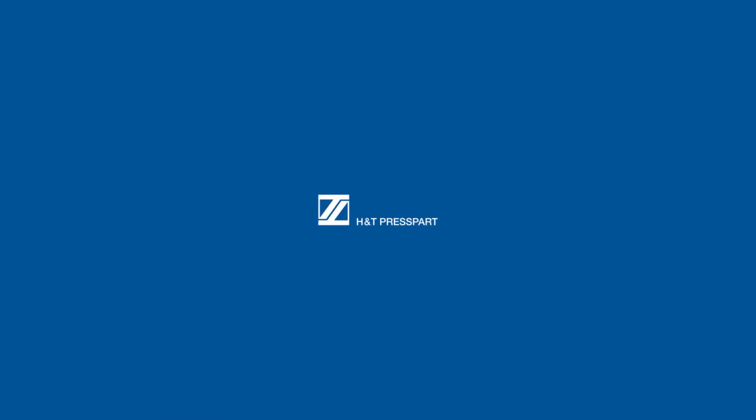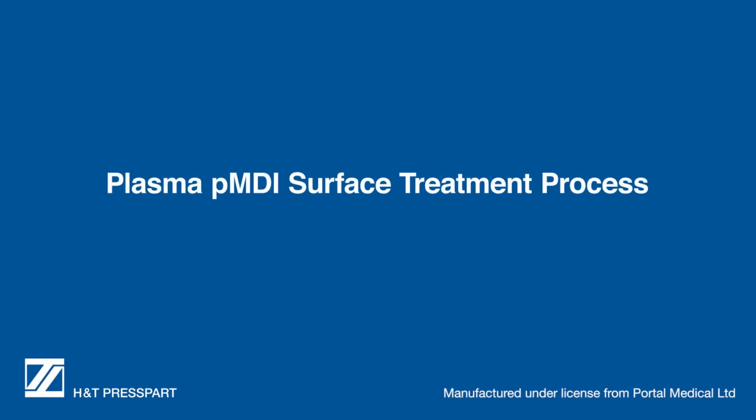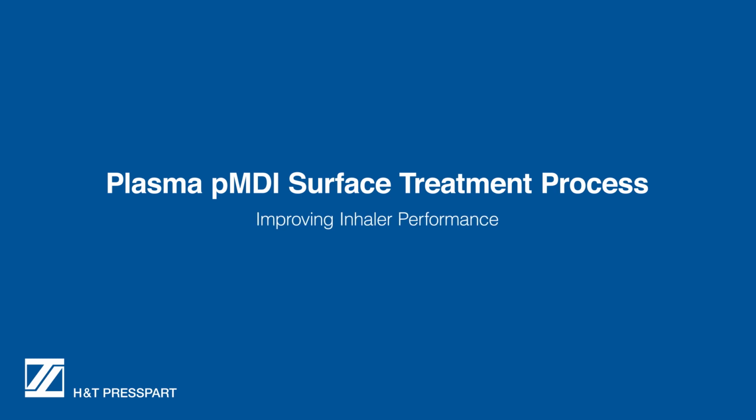Welcome to H&T Presspart, a market leader in the manufacture of respiratory drug delivery devices and components. Today, we would like to introduce you to our Plasma MDI surface treatment manufacturing facility. Our patented plasma treatment process helps reduce drug degradation and adhesion and improve inhaler performance.